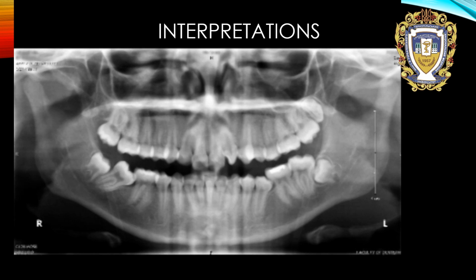Assess the structures of the nasal cavity, including the floor and concha, which extend horizontally along both sides of the image, and the nasal septum. Note the soft palate, imaged bilaterally as it extends off the posterior aspect of the hard palate.